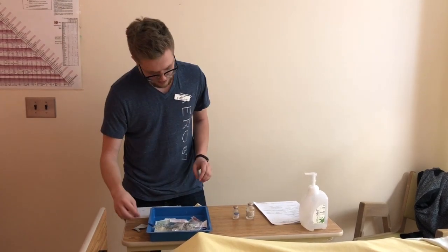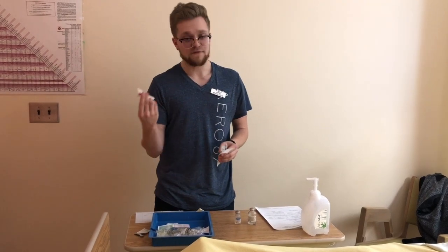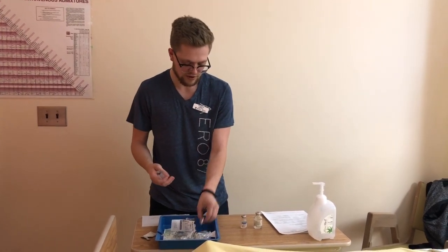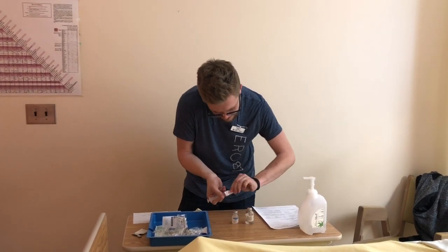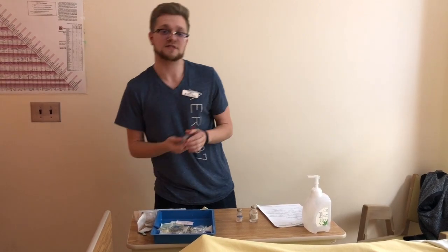Perfect. Then I'm going to use my 10 milliliter syringe here. I have my blunt fill as well. We're going to be taking these out, and this is what I'll be using to take out water and then finally the medication later. Open this up. Okay, perfect. So we're going to take out 6.8 mLs of sterile water.